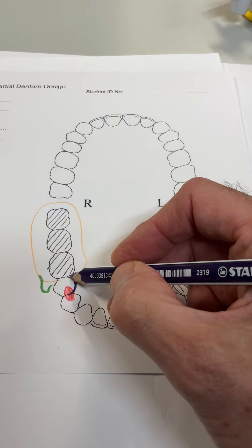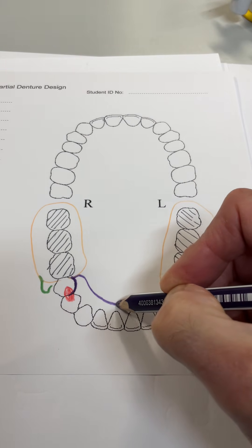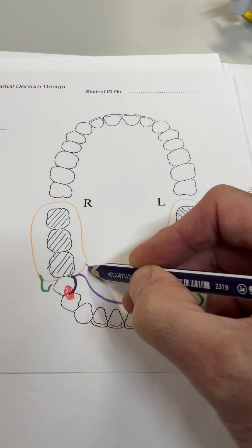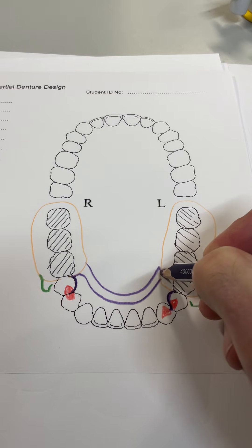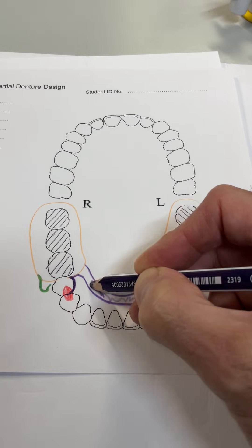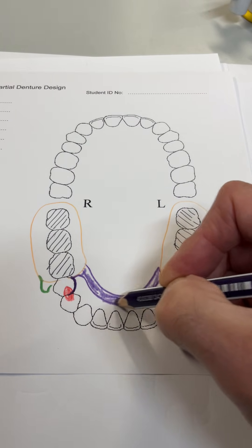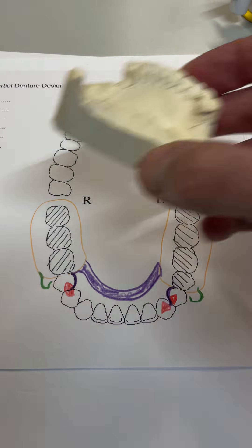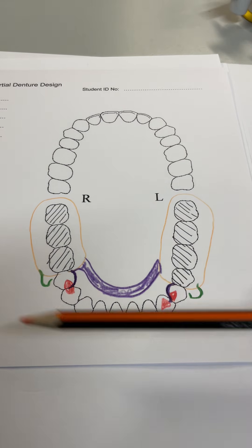Now we just need to join it up to make the denture base rigid. We bring a lingual bar all the way around, which is rigid, non-flexible. So there you have your major connector and lingual bar. Kennedy Class 1 lowers are probably the least worn denture you can make for anybody because they move. We've got plenty of depth for a lingual bar, so it's not an issue.